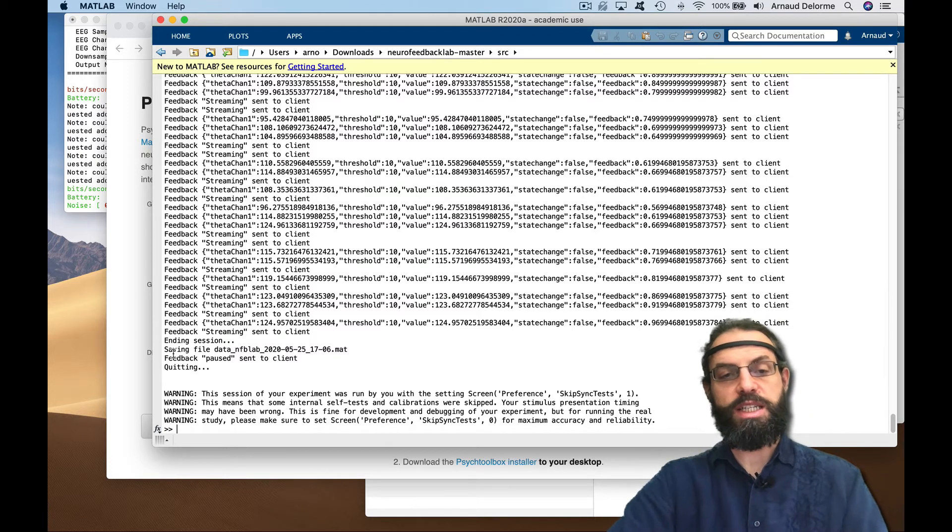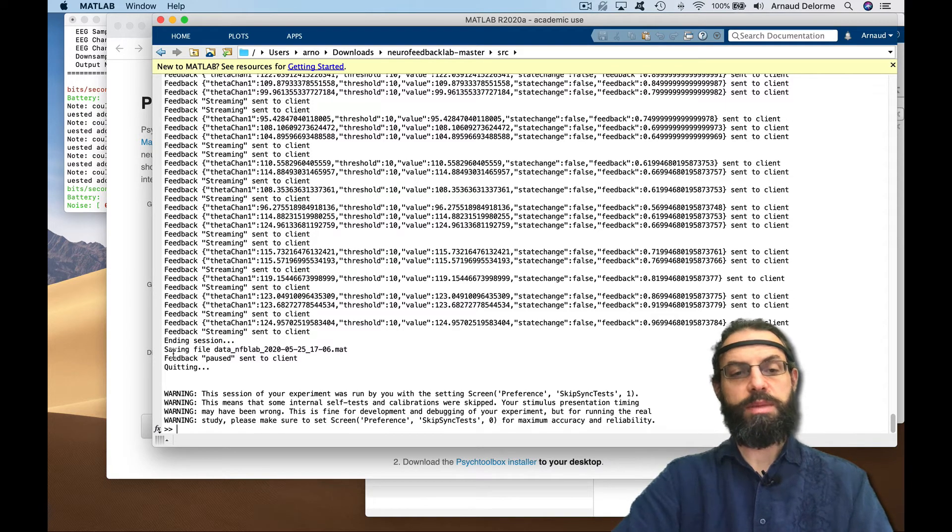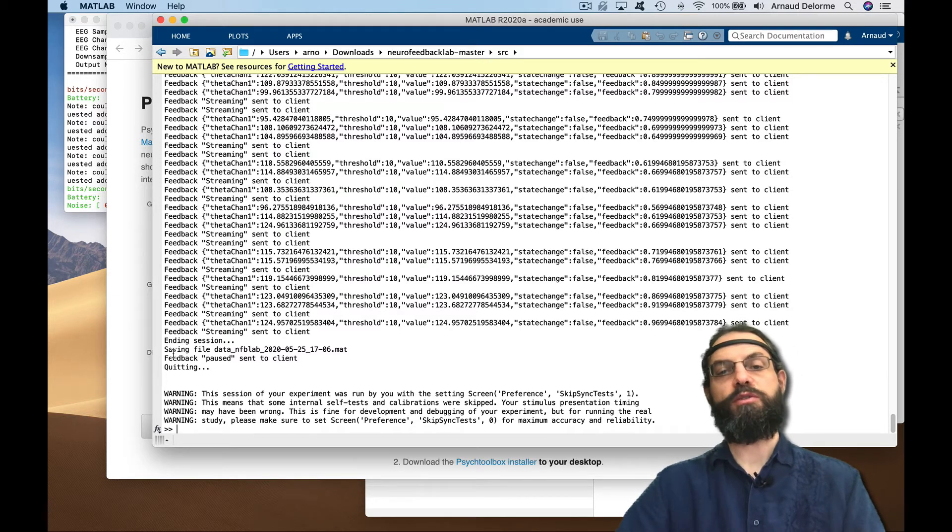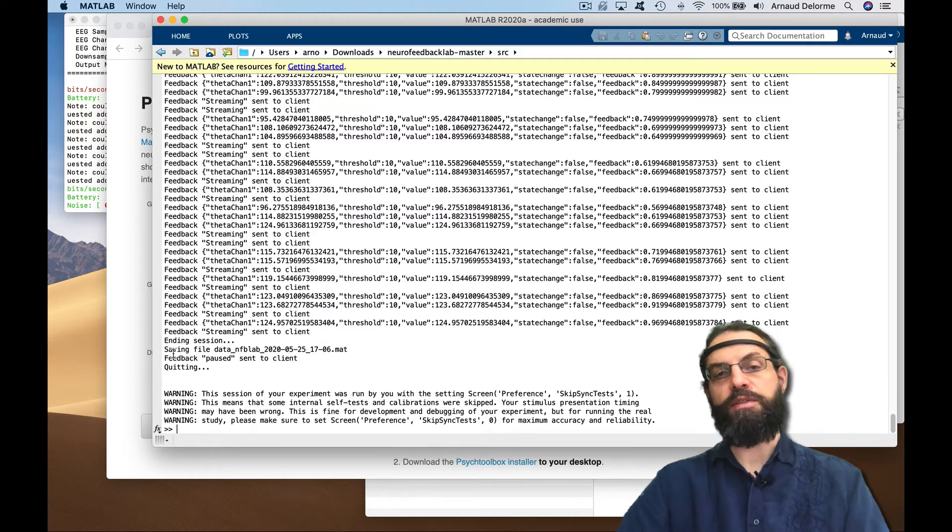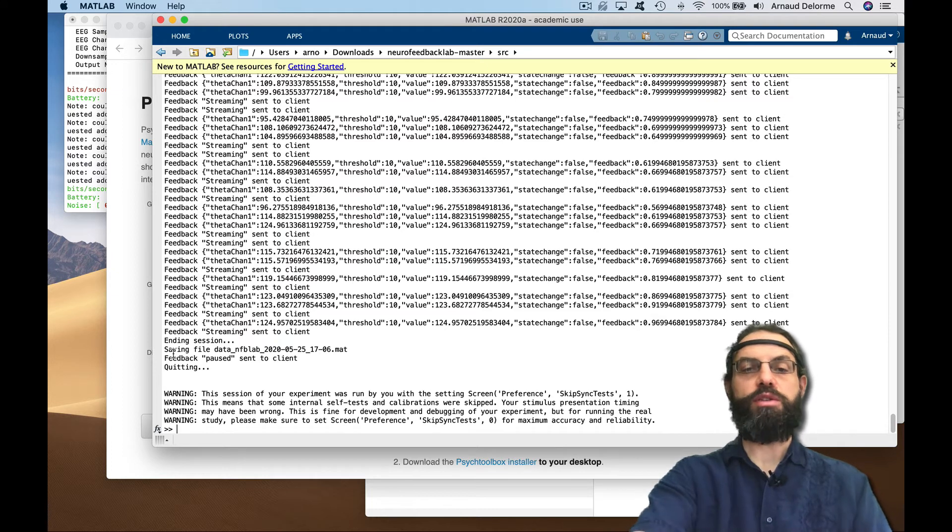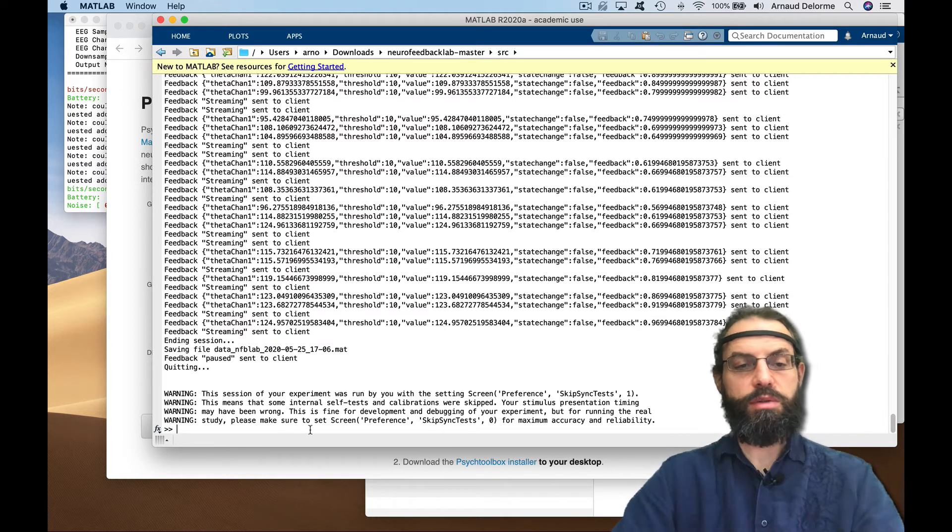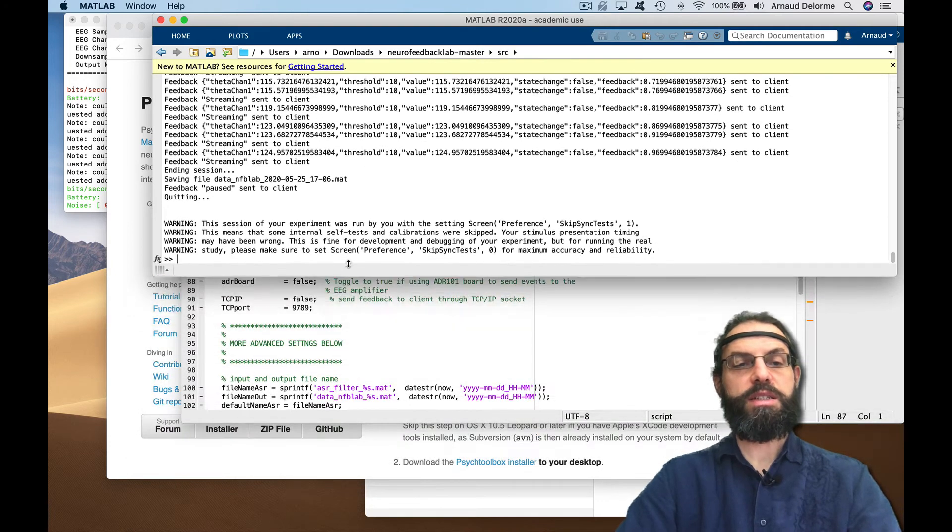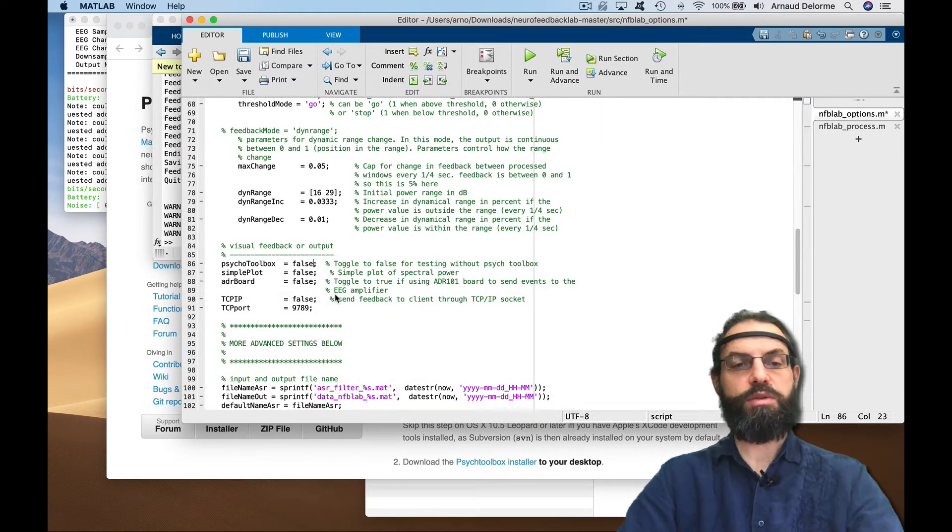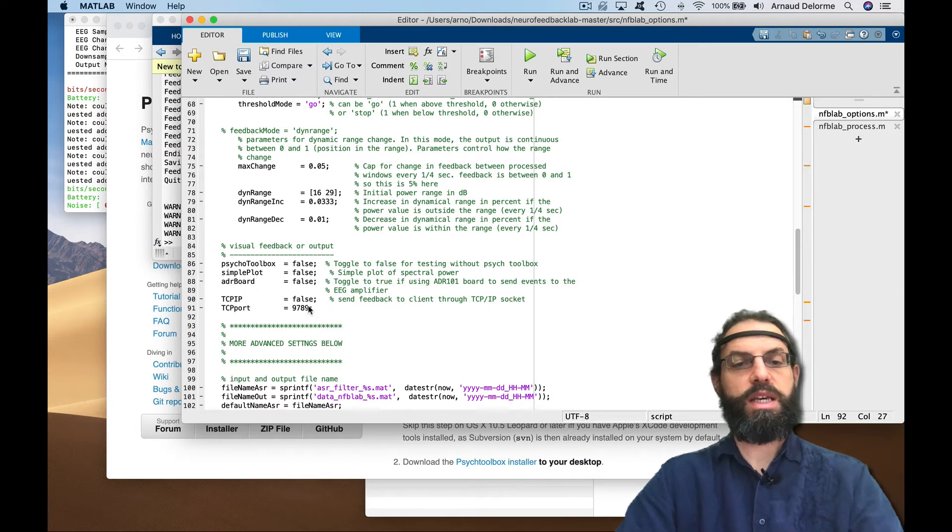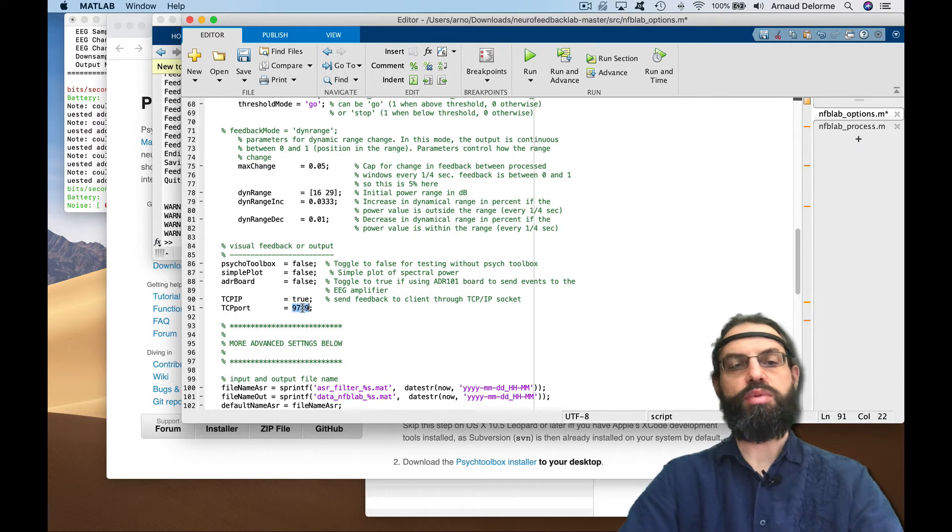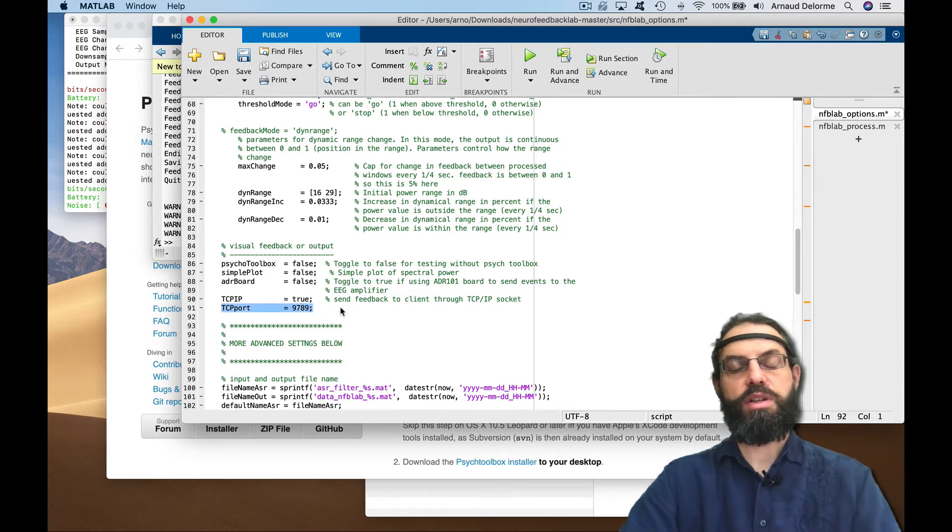Here's just a demo, so it doesn't last very long. Usually sessions are about five minutes. You can do whatever you want with the psycho toolbox. That's the second way to run it. Then there's a third way to run the program using TCP IP messaging with a third-party program. I'm going to change the options again. I'm going to put the psycho toolbox to false and then TCP IP I'm going to set to true. You can choose any port you want as long as it's open through the firewall. I have to put it in slave mode so it's waiting for connection.